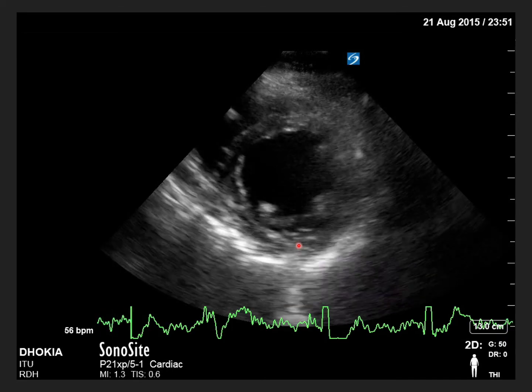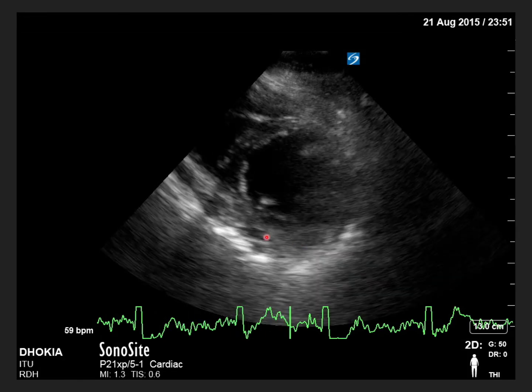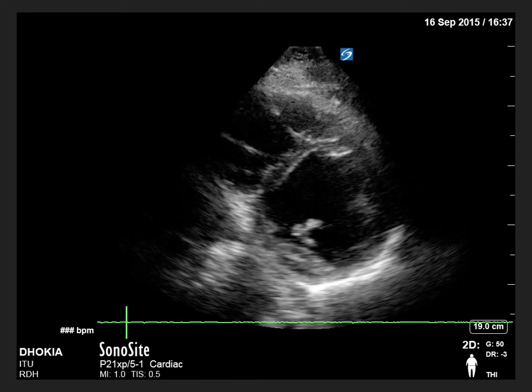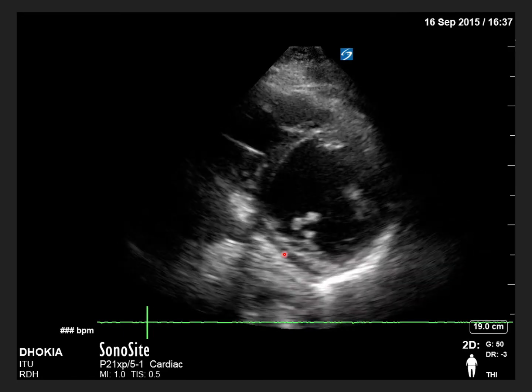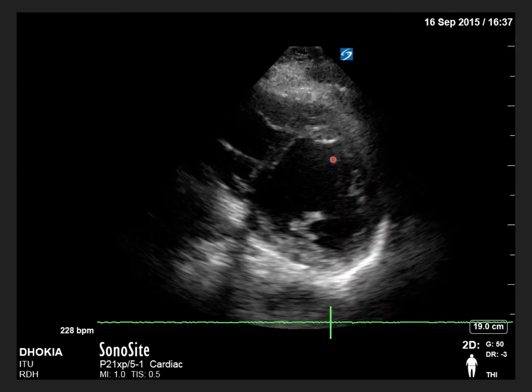In this example, the left ventricle is completely collapsing and squeezing all the blood out — indicating good LV function. In the next example, the left ventricle is barely contracting — this is a sick heart.